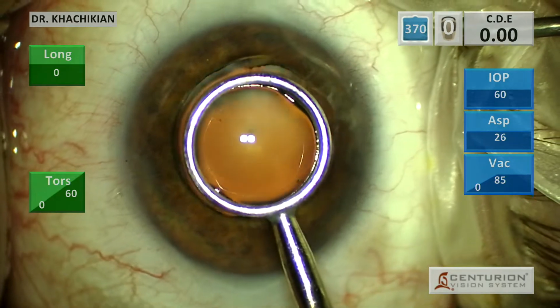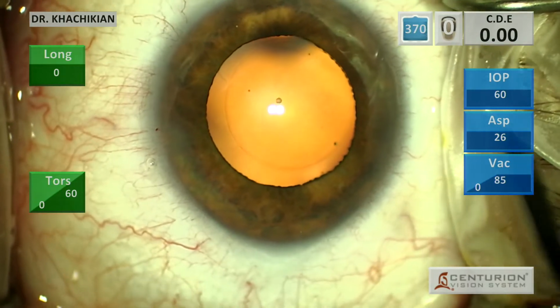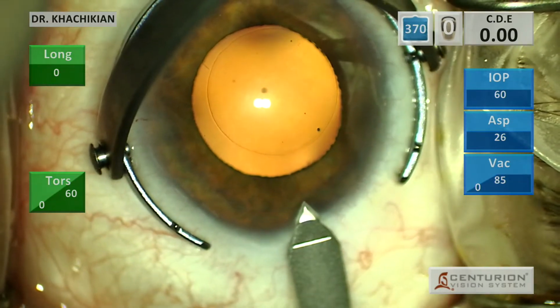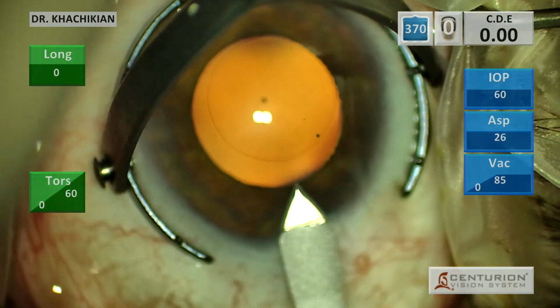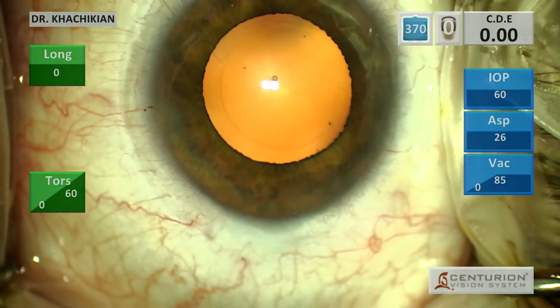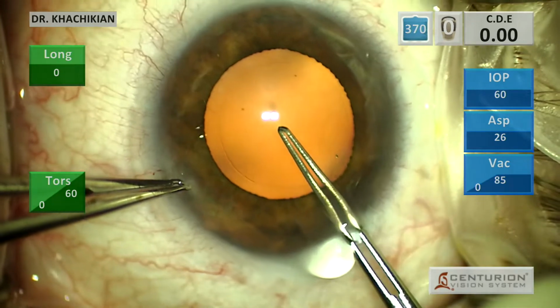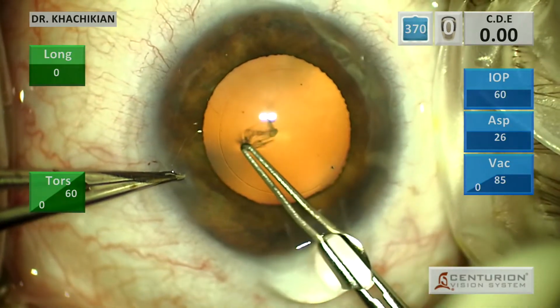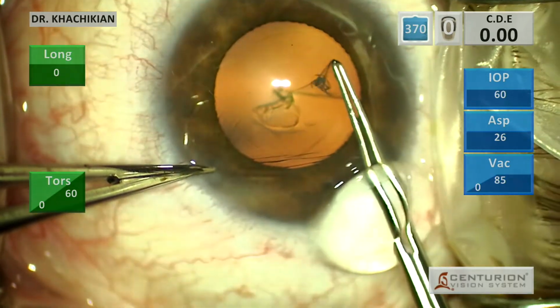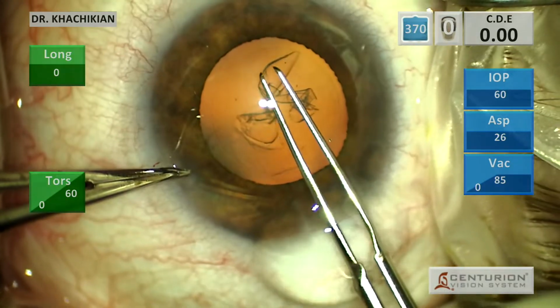And then I would usually mark the surface of the cornea with a, I think it's a 5.25 millimeter marking ring. And then I'll make a main incision. I use the fixation ring with the spikes pointed up to not cause any damage to the conjunctiva. And then I enter very slowly with a 2.4 millimeter blade. I tend to make a single plane incision because I really do feel that it seals better than a triplanar incision. I also like the configuration of the single plane incision.